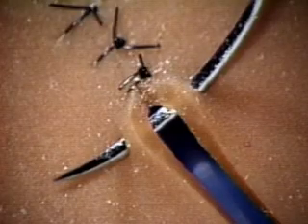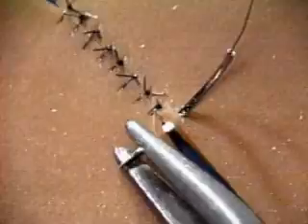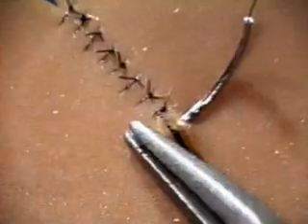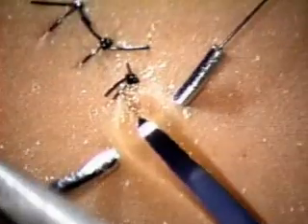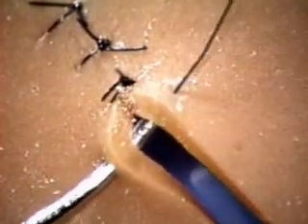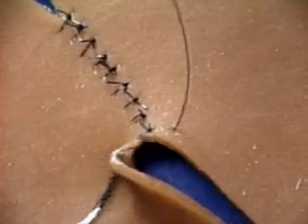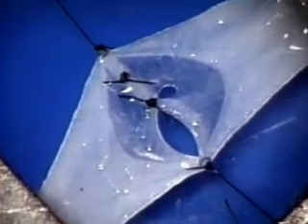You've put the needle tip in and brought it out. Now you have to pull the length of the needle through. Remember, pulling is more controlled than pushing. Pull the needle through with 1 or 2 straight pulls so that its tail end rides cleanly through the needle hole. Avoid pulling it sideways. That's very traumatic. If you do that on a blood vessel, here's what you'll get: a hugely enlarged needle hole.